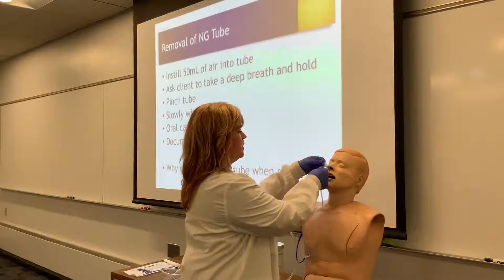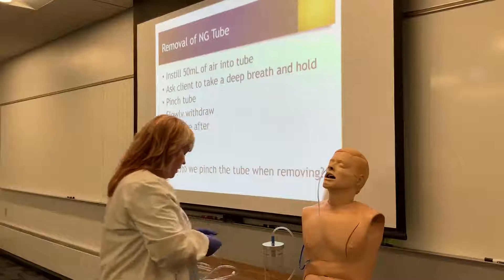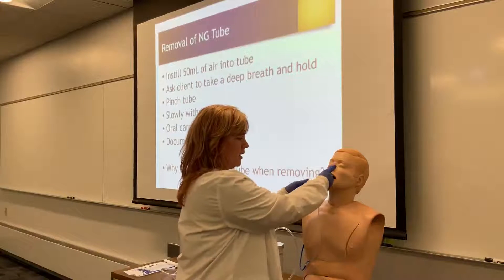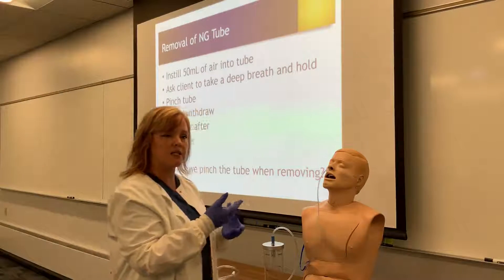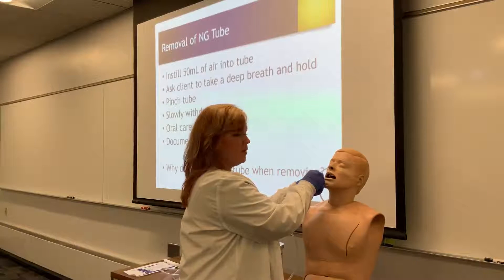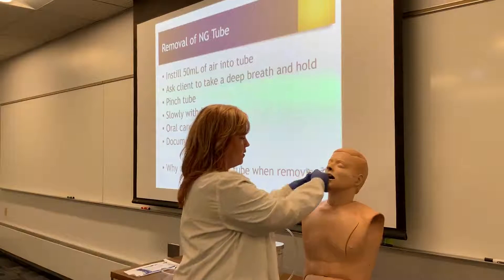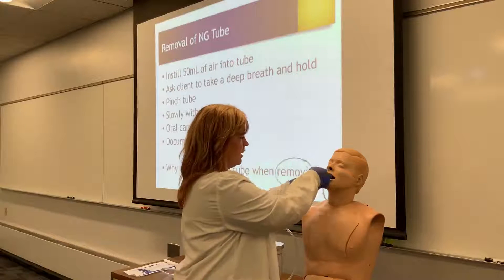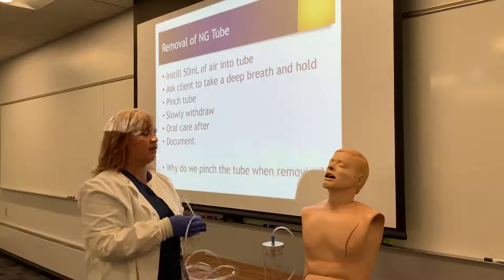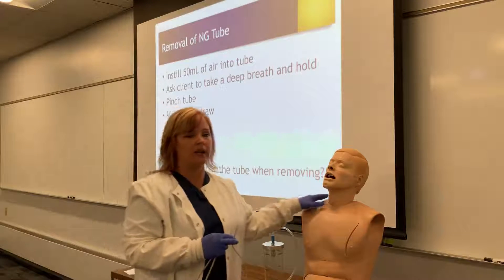We'd make sure all the tape is removed and we're ready to pull the tube out. We want to have our emesis basin ready, and I might have a towel here to catch any stomach contents that come out on the tube during removal. I want to pinch the tube and ask the patient to take a deep breath and hold it. I pinch the tube and begin to pull it out gently but swiftly, making sure to cover their face so no stomach contents get on their mouth. Pinching the tube, holding breath, and having flushed the tube with air all decrease the risk of aspirating any stomach content.